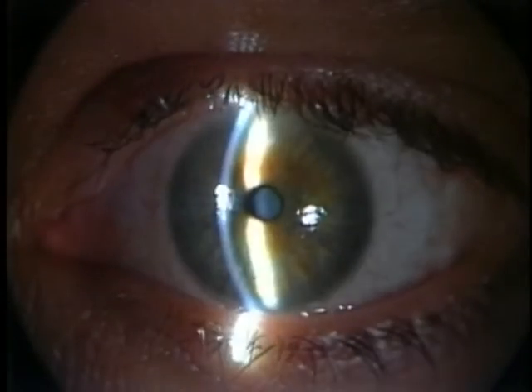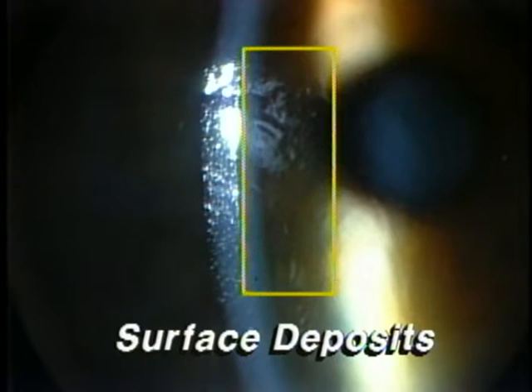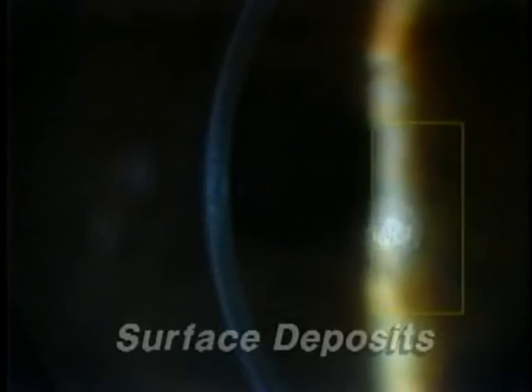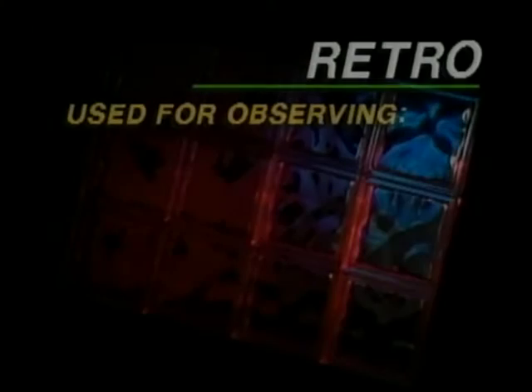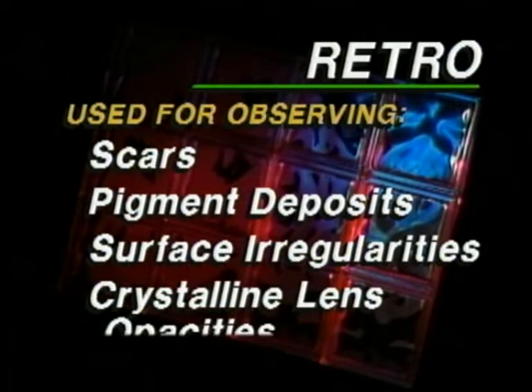Moving the slit beam further out of click-stop results in indirect retro-illumination, where the light path is positioned adjacent to the lesion to diffusely illuminate it from behind. Returning the beam again demonstrates direct retro-illumination, and continuing further returns the beam to the direct parallelopiped view. Indirect retro-illumination is used to observe surface deposits on a soft lens, easily viewed in the area adjacent to the direct beam, whereas this detail is washed out by the intensity of the direct beam itself. Direct retro-illumination is also used to observe soft lens surface deposits, with the light reflecting off the iris illuminating the deposits from behind. Retro-illuminations are used to observe scars, pigment deposits, surface irregularities, and crystalline lens opacities.